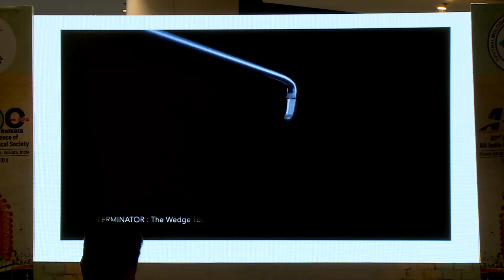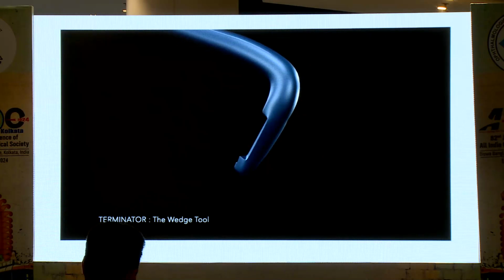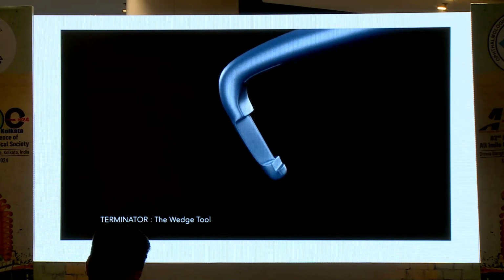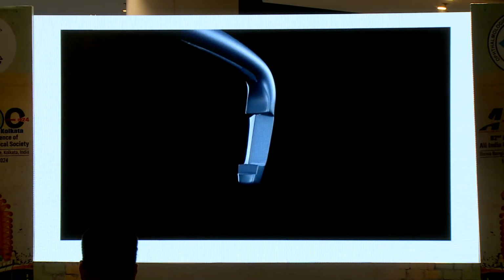So this is the specially designed terminator chopper, blunt olive tip. So there is no chance of PCR or posterior capsule damage. So this is how it looks. Right?